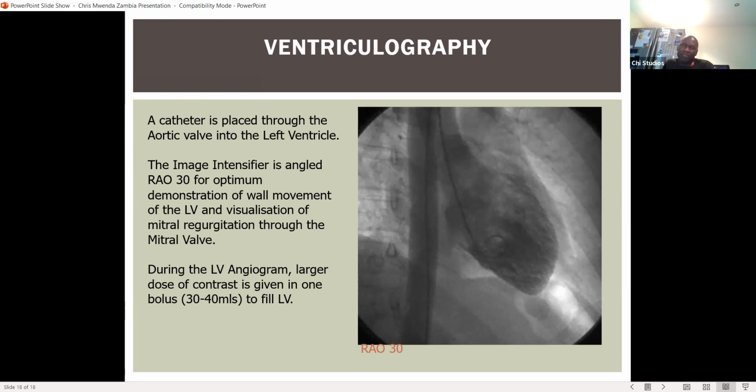However, there are certain patients who are having a heart attack who come from home. We call it primary PCI. These are emergency patients who are just having a heart attack at home. One of the things in the NHS program is that when someone is having a heart attack, they have to be in the hospital within 90 minutes, and within 110 minutes the patient should be on the table. Regardless of which section they are coming from, that's the gold standard of doing things.